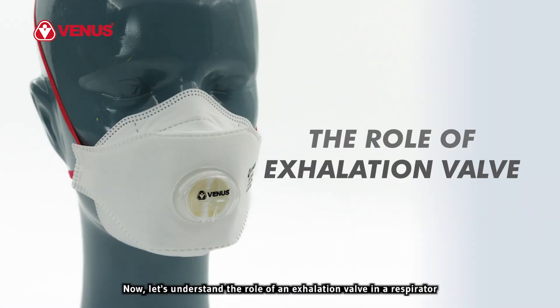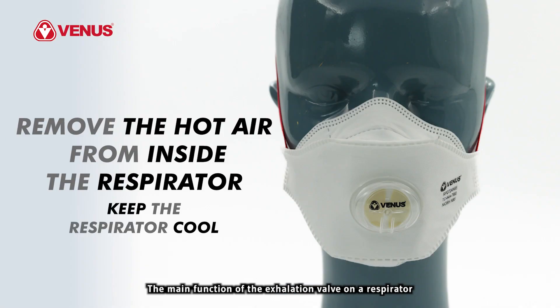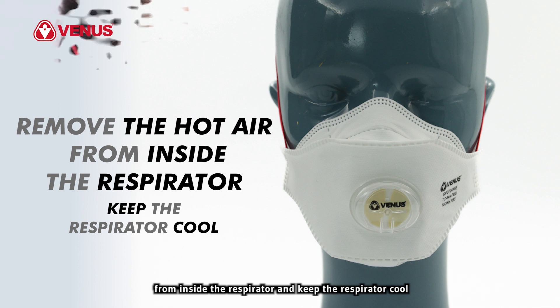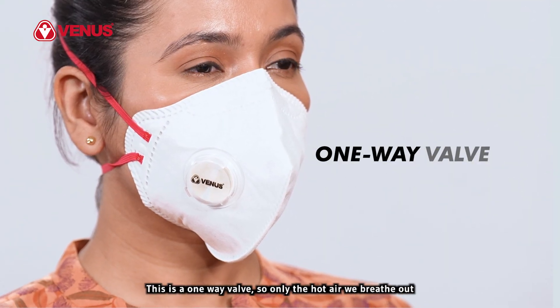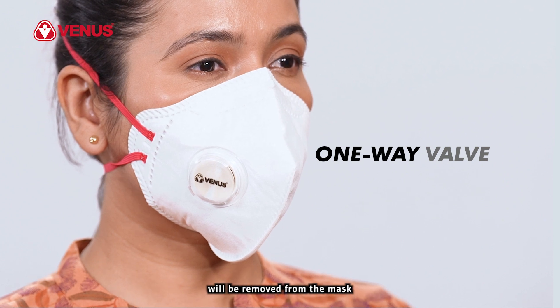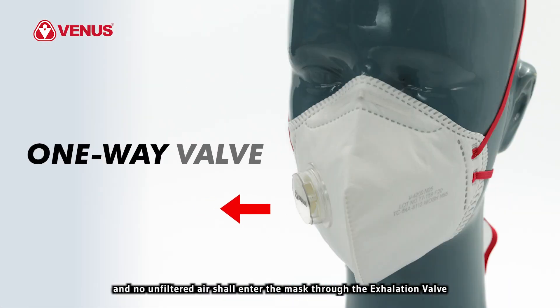Let's understand the role of an exhalation valve in a respirator. The main function of the exhalation valve on a respirator is to remove the hot air that we breathe out from inside the respirator and keep the respirator cool. This is a one-way valve, so only the hot air we breathe out will be removed from the mask and no unfiltered air shall enter the mask through the exhalation valve.